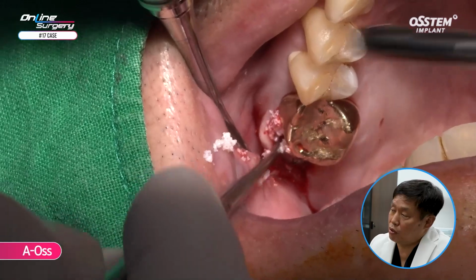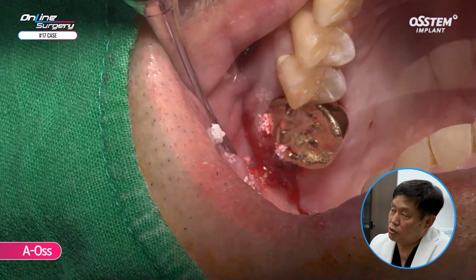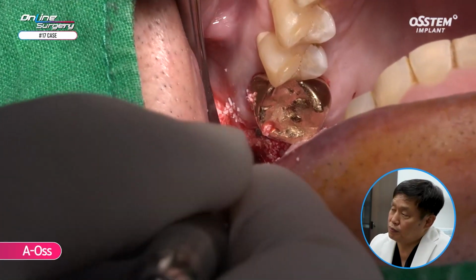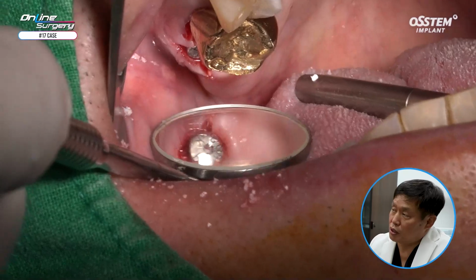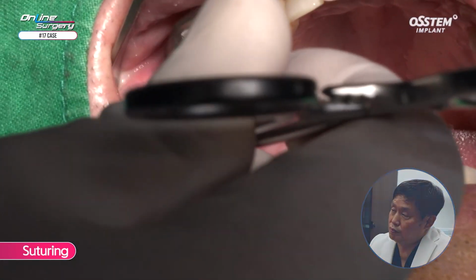On the buccal side, flap reflection was not done excessively. Sufficient bone packing was done on the buccal side. Because this was minor incision, suture was performed as shown.